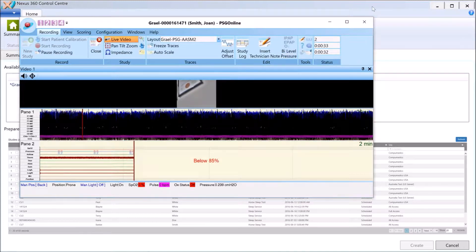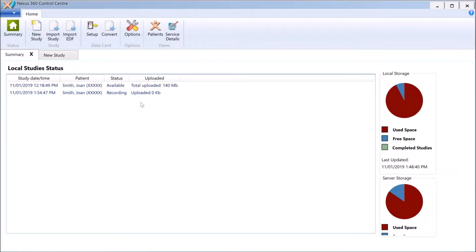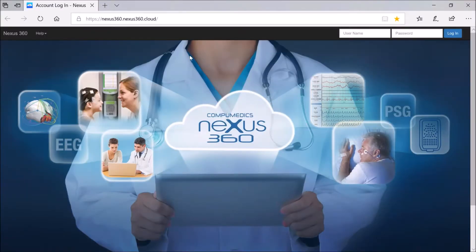In my instance I have a cloud server set up, but you can also have an on-premise server. If we go back to the Control Center — minimize PSG Online and go to the summary data — we can see Jane Smith is doing a recording. In simple terms, it uploads in a batch process, so once it reaches a certain size it will upload. You might see it sitting on zero for a little while.